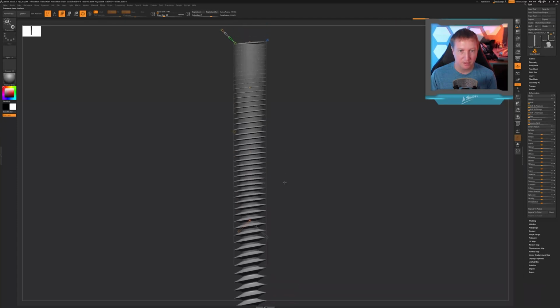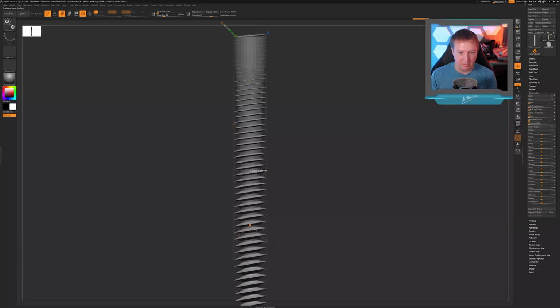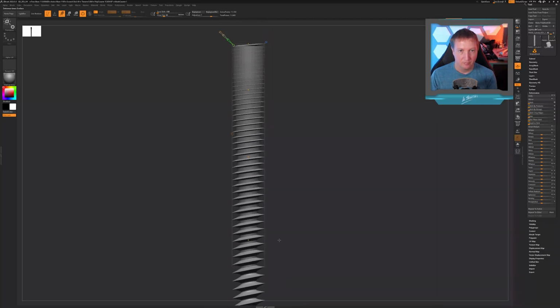I forgot to hold shift there. All right, these ones actually need to be spaced out a bit more, so let's bring these down. And then we need to bring this down more, and we're just going to have to trim this one more time. All right, I think that looks pretty good. We might have a few too many threads on this screw, but let's just roll with it.